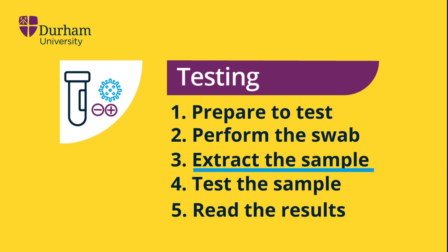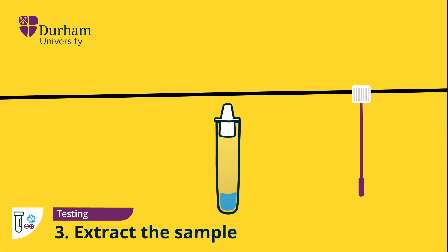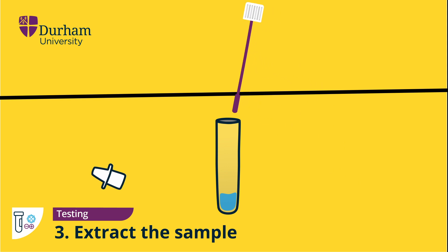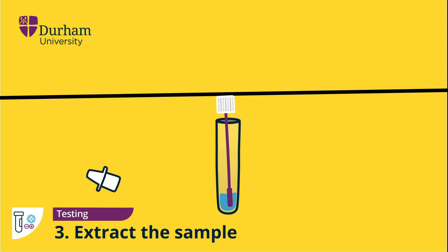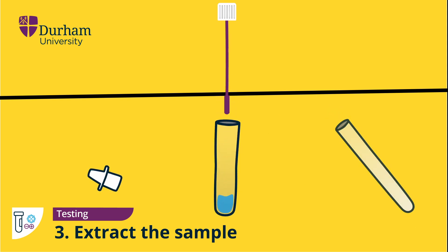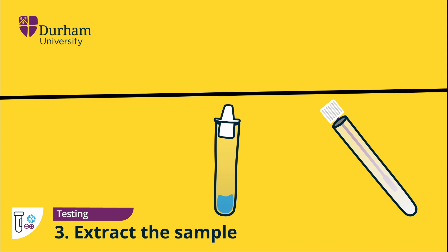Extracting the test sample. Remove the dropper lid from the tube and, ensuring the fabric tip is facing downwards, place the swab into the tube and swirl it around for 10 seconds. As you remove the swab from the tube, squeeze the flexible sides of the vial to ensure as much liquid as possible is drained from the swab. Place your used swab back into the container it came in, then place the dropper lid back onto the tube to prevent spillage.